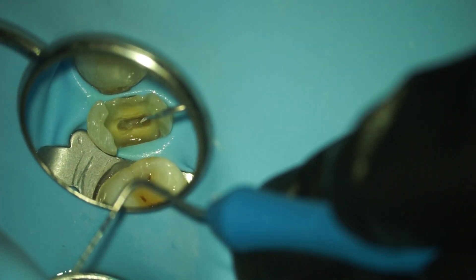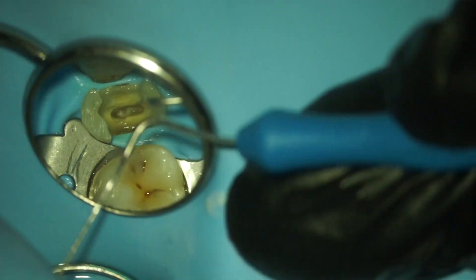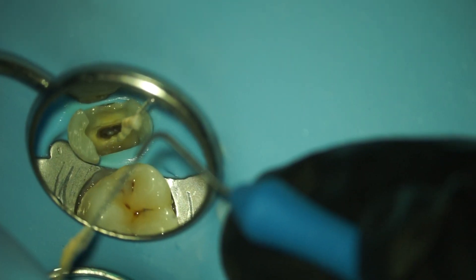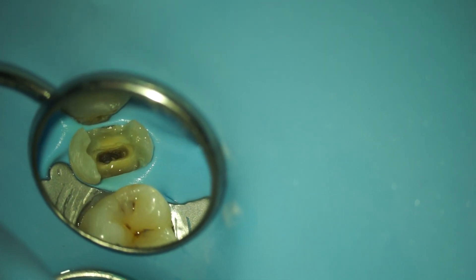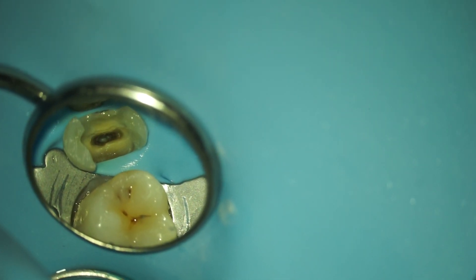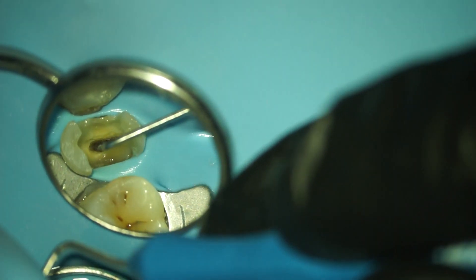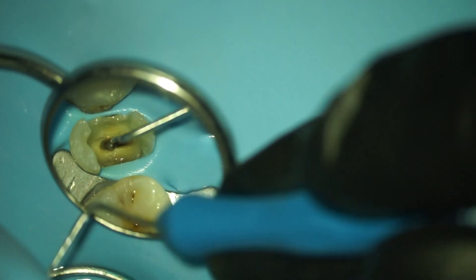This is when the cusps are removed. Here I'm removing a little bit more debris with the micro opener. I really like micro openers — they're really easy to use and come in very handy, as you'll see later on.